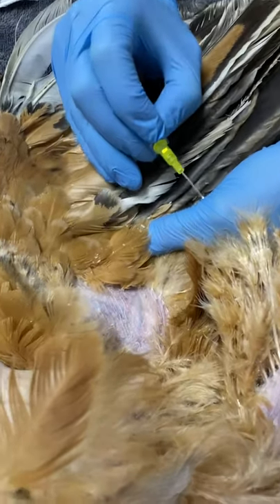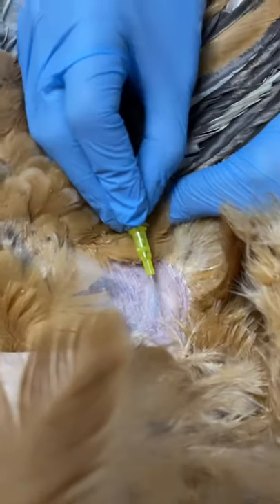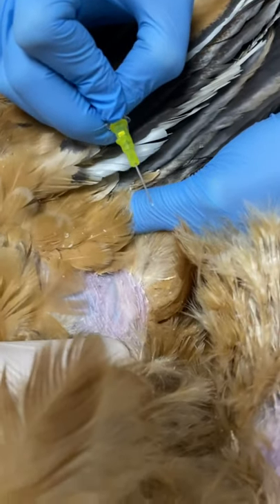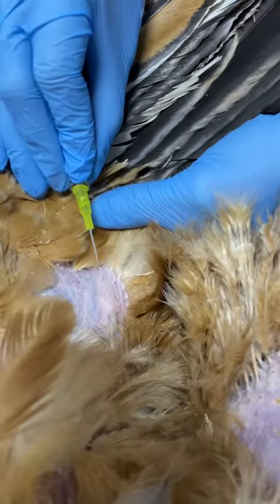We're going to place an IV catheter into the basilic vein, which runs over the point of the elbow. We've plucked a couple of feathers. You have one person raising it — my finger is just there raising that — and the other person will place the catheter into that blood vessel.